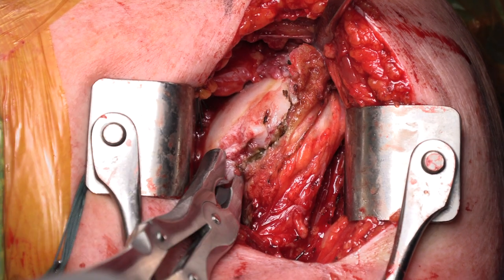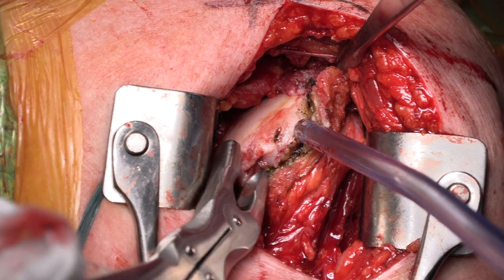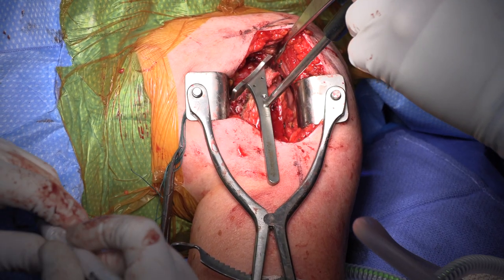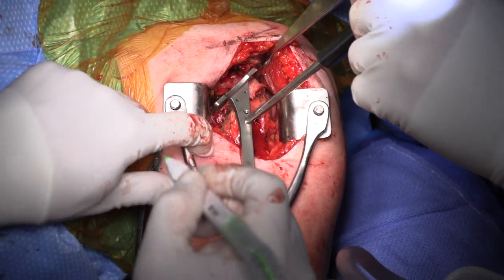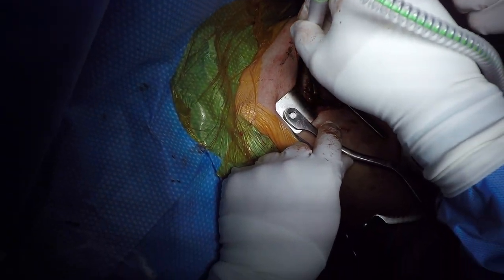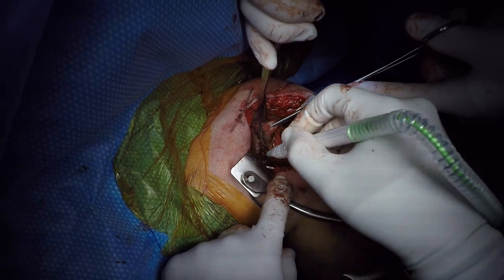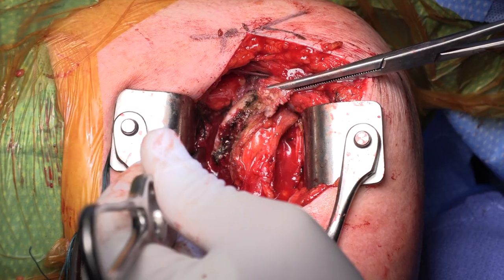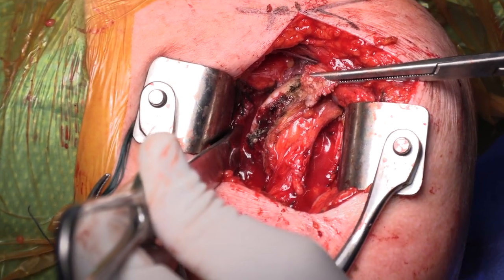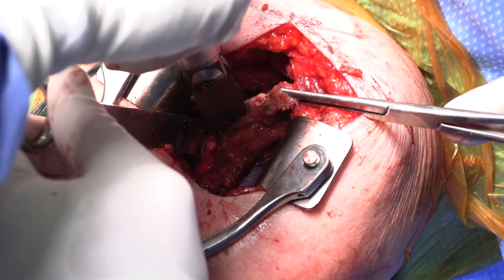At this point, the entire articular surface of the humeral head is visualized. The peripheral osteophytes are removed with the rongeur. The location of the humeral neck osteotomy is determined based upon the anatomic landmarks. The humeral neck osteotomy is performed using the angled cutting guide, and the angle of the resection is first marked using electrocautery. Since the mean humeral head retroversion is 25 degrees, the osteotomy is performed to maintain approximately 25 degrees of retroversion.